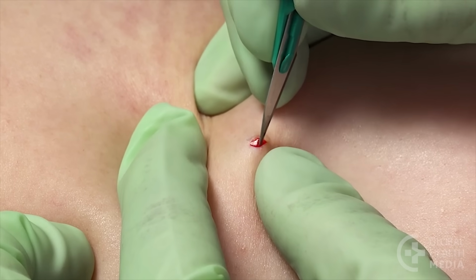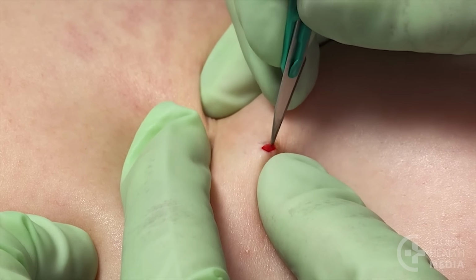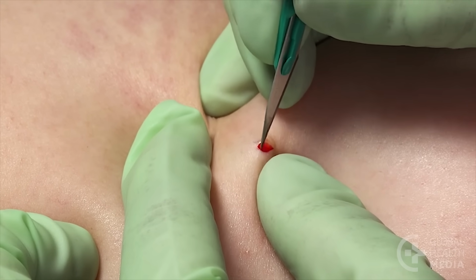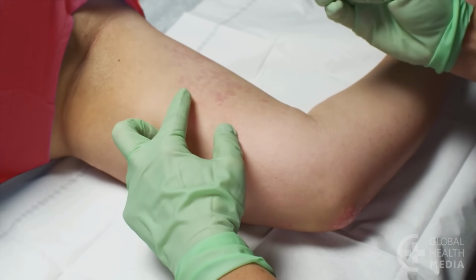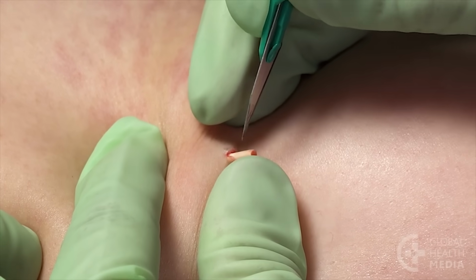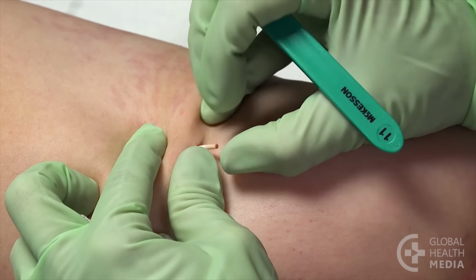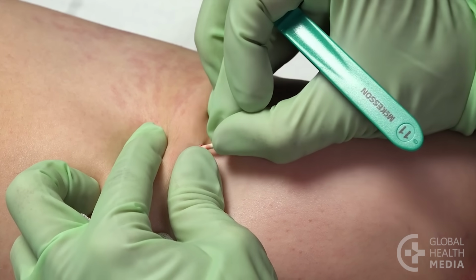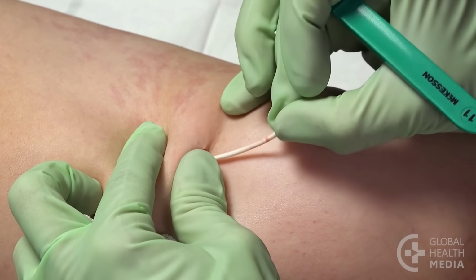Then use the tip of your blade to gently nick away at the fibrous tissue that has formed around the end of the implant. Once the fibrous tissue is loosened, the implant will usually pop out of the incision. This method is preferred because it causes the least tissue damage and is usually quick and easy.